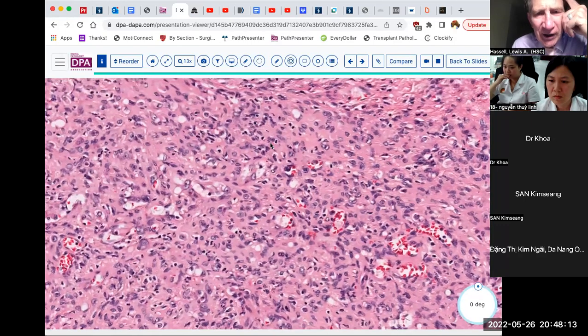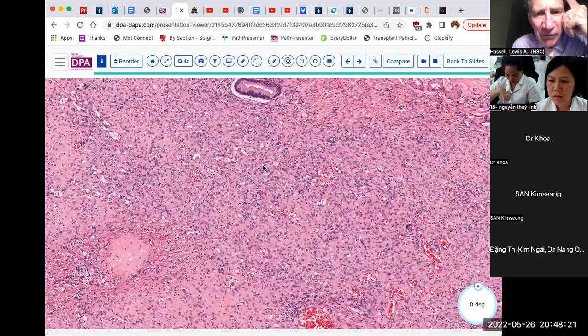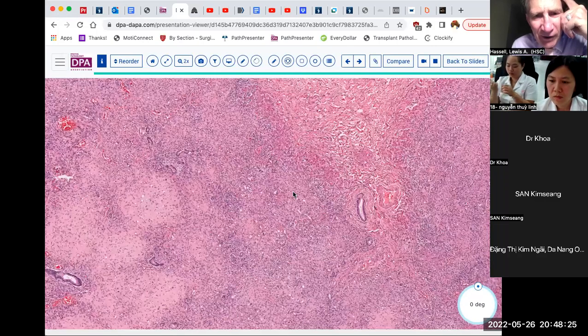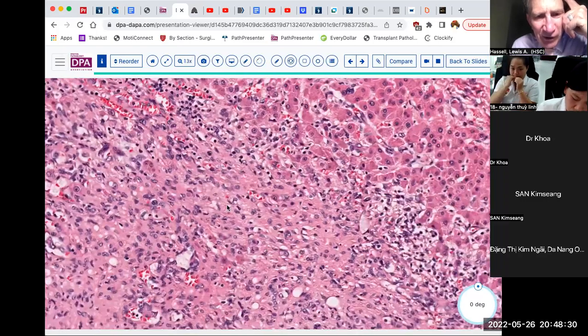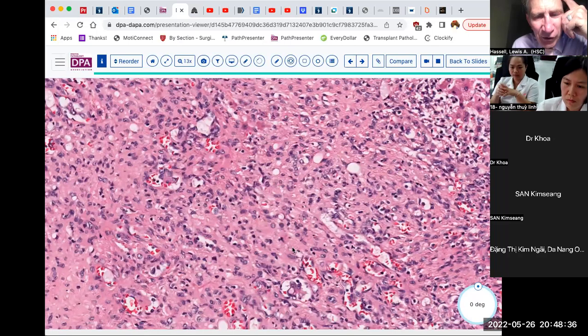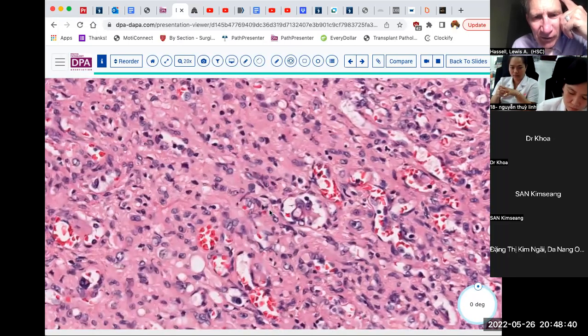Here you're seeing more of these epithelioid cells and the vacuoles that we've mentioned before. So if you can get to an area of the periphery, that can help you to identify the lesion. And here's the interface between the lesion with these pale epithelioid cells and the hepatocytes that it's taking over. So here in these more cellular areas, there's a nice atypical giant cell from this lesion.